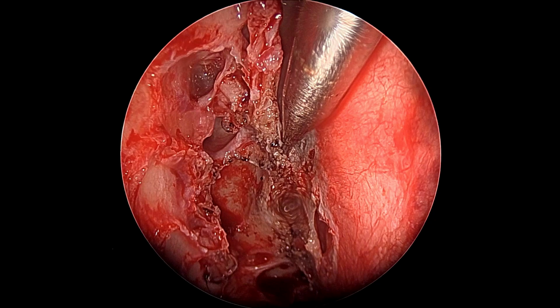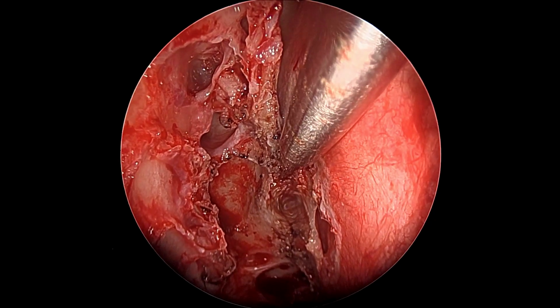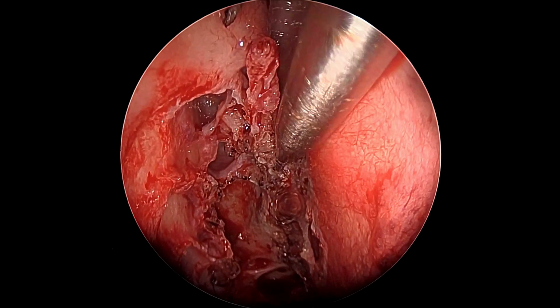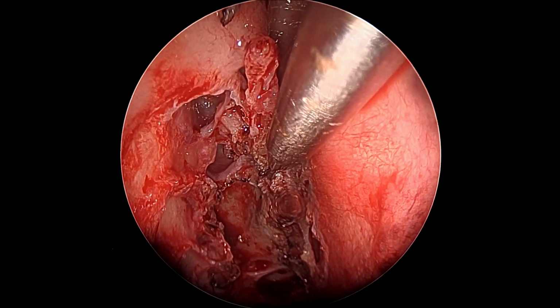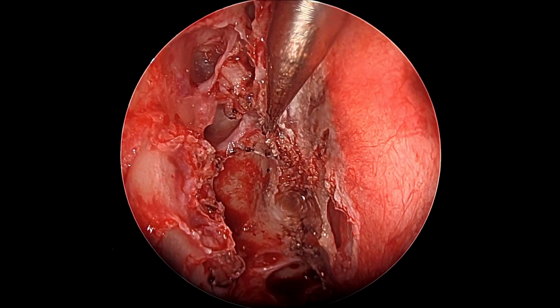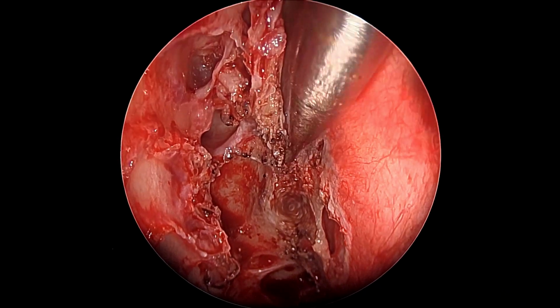So even if in this attempt one goes a little overzealous and sometimes makes the defect slightly larger, there seems to be no problem with that. One must not panic, because normally slightly larger defects are much easier to close than very small ones.